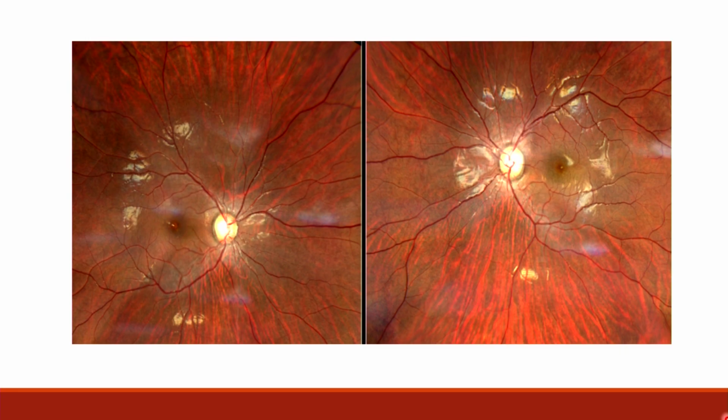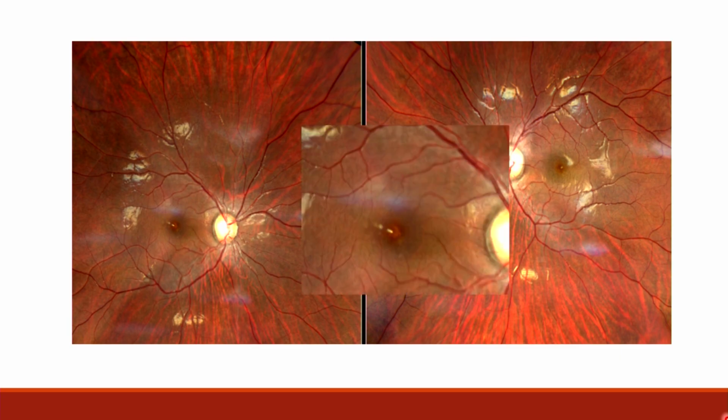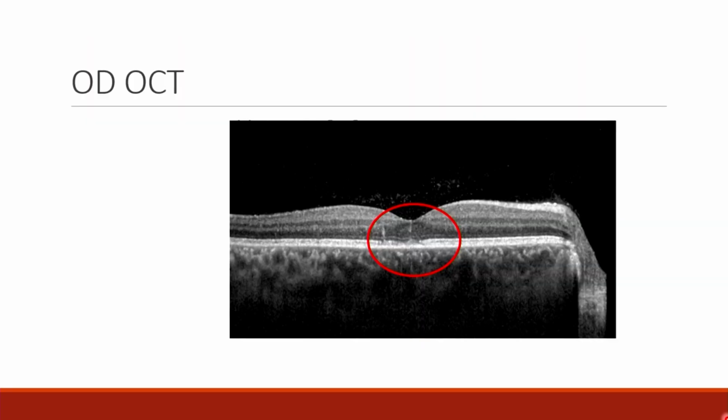This was the fundus photo of the right eye concentrating at the fovea. Pale hypopigmented punctate spots were seen in the right eye, around the fovea and within it, and the left eye was within normal limits. The periphery was normal. This can be seen closely, few pale hypopigmented lesions visible just around the fovea. So this is the area to be focused on.